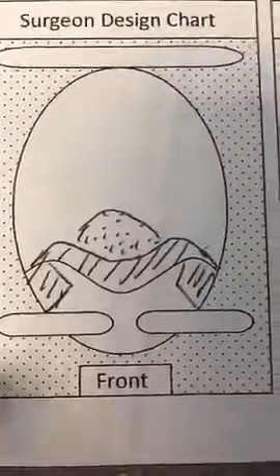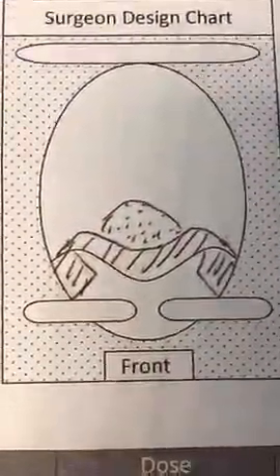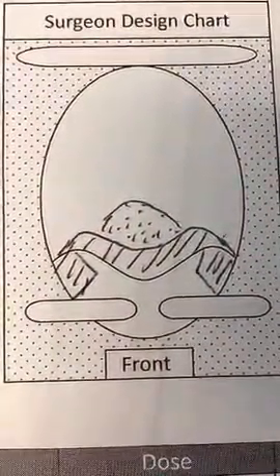We're done with the procedure. We put over 1800 grafts on temples, front and the area on the mid. This is how it looks. This is the front and the temples and the top area with less density, but we covered pretty much everything that we were planning to.